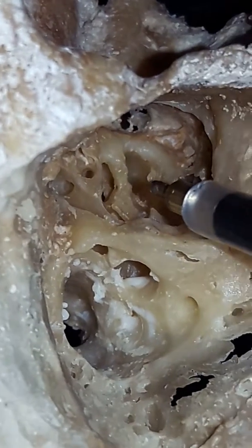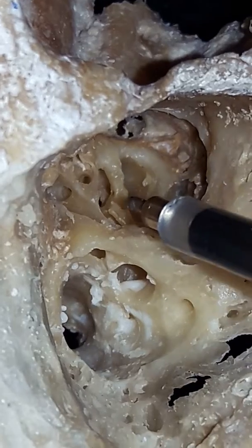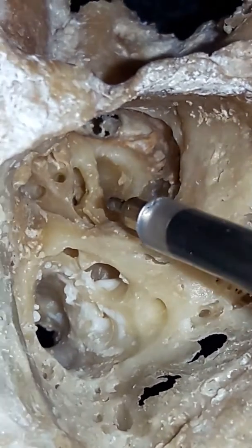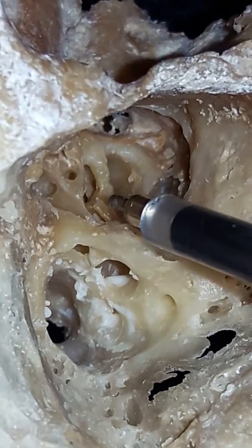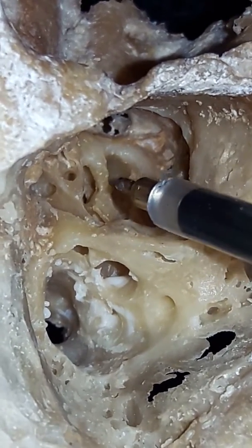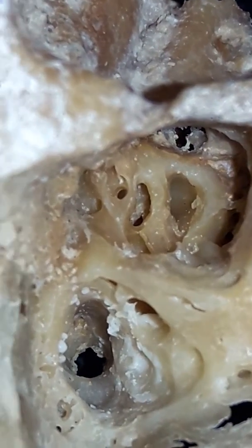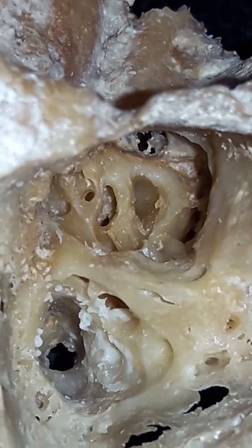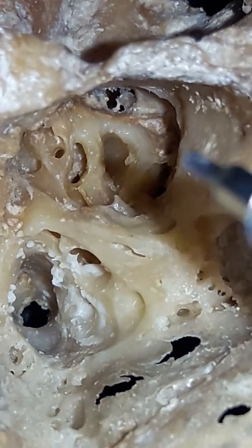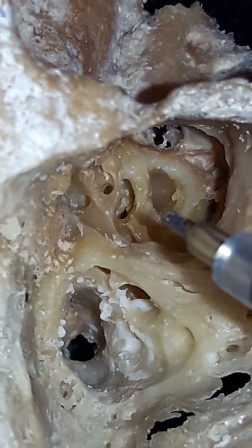Here, after drilling out this scala tympani, a basal turn drill out, the scala vestibuli is lost. Just above this, over the osseous spiral lamella, you will see the scala vestibuli. Now in the basal turn, there is no demarcation in this specimen between the scala vestibuli and the scala tympani.